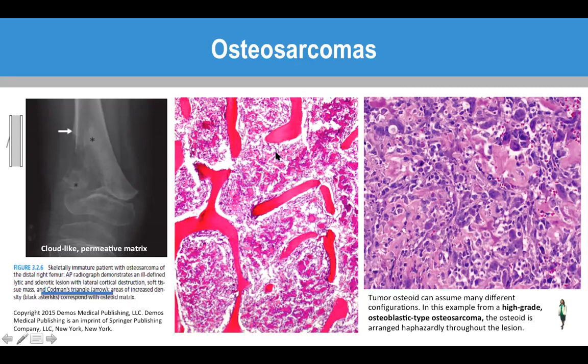And you look at this, it has some bone fragments and has some tumor replacing the marrow space, and this tumor is producing this immature bone called osteoid. When you go to high power view, we see all those malignant looking cells. They have big, dark, and ugly nuclei. So it's definitely malignant because they're producing this immature bone called osteoid. So this is a high-grade osteoblastic osteosarcoma.